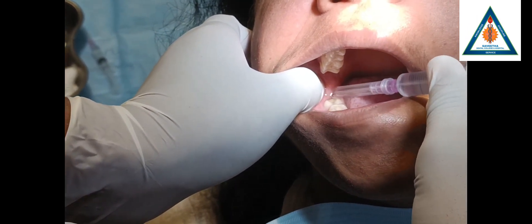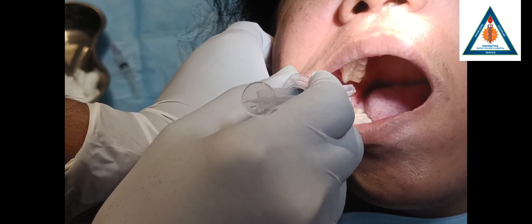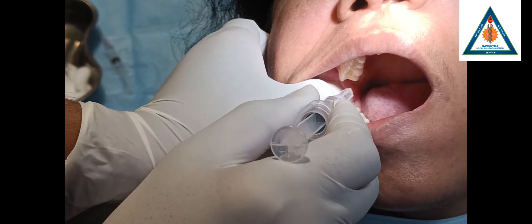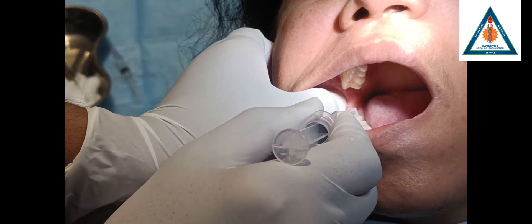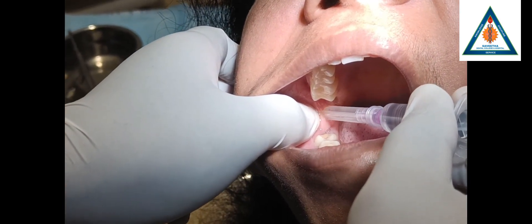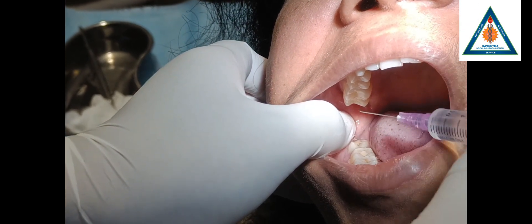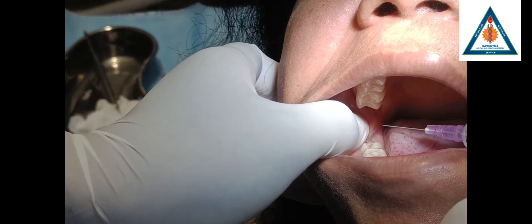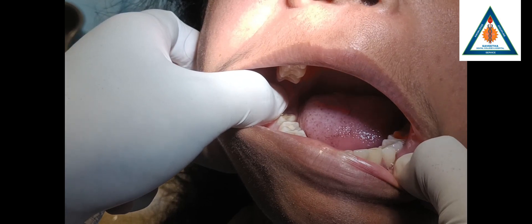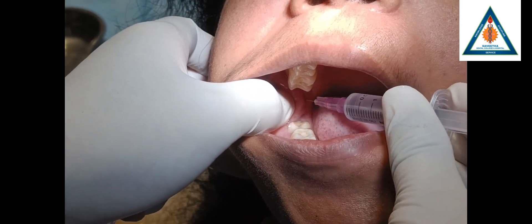You can see the pterygomandibular raphe running upwards. A line in the middle of the thumb finger will be the imaginary line, and it has to be 8 to 10 mm — or you can consider 6 to 10 mm — above the occlusal plane of the last tooth. So this will be my point of needle insertion. I will be going on the opposite side of the premolar, and my point of insertion will be here.